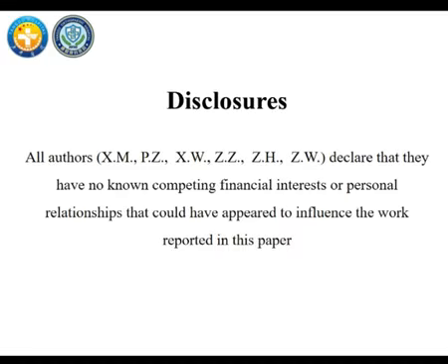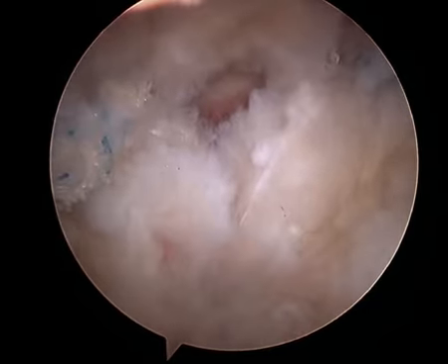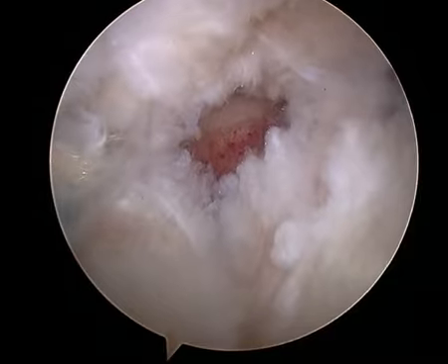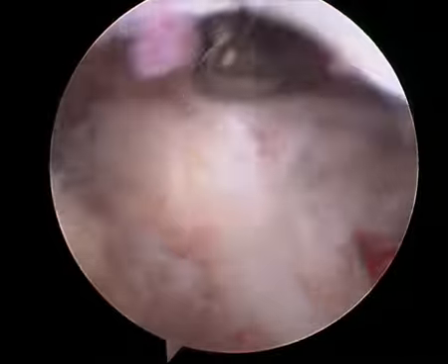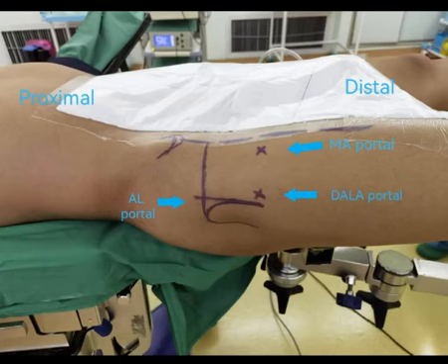The T-capsulotomy is one of the most common techniques in hip arthroscopy for FAI. However, T-capsulotomy often presents a technical challenge during suture closure. The central crossover region of the T-capsulotomy results in inevitable capsule deficiency, potentially compromising the iliofemoral ligament integrity. We now present a technique to address this limitation.